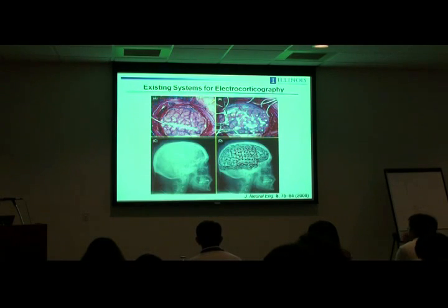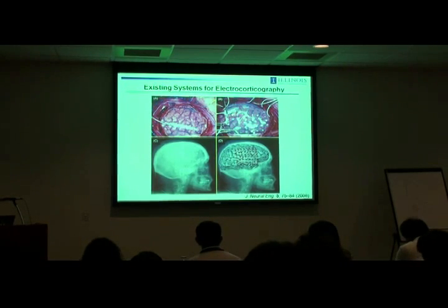And the output of measurements made at each of these different electrode sites is used to develop a map of electrical activity on the surface of the brain. And then you try to identify the region of the brain that's responsible for the seizure. And then you just cut it out. That's the way it works. And so you can imagine this kind of technology is quite primitive.